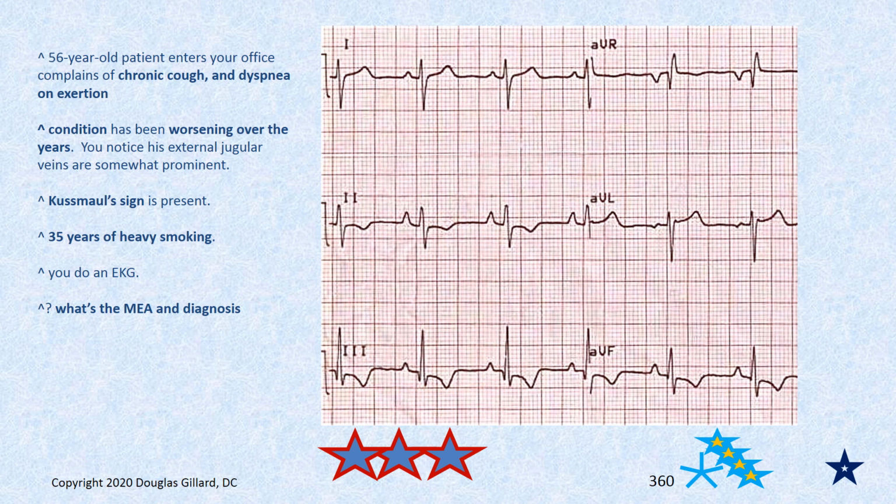Okay, who's biphasic? Find who's biphasic. AVR is kind of biphasic, but I said stay away from AVR if you can at all help it. Oh, limb lead 2 is beautiful, right? Limb lead 2 looks great. I can already tell you the answer to this, but we haven't. By looking at the P wave is funky. But we're not focusing on the P wave, just the QRS complex.